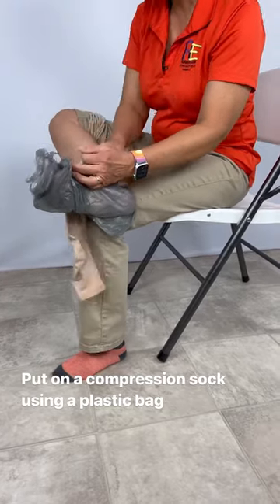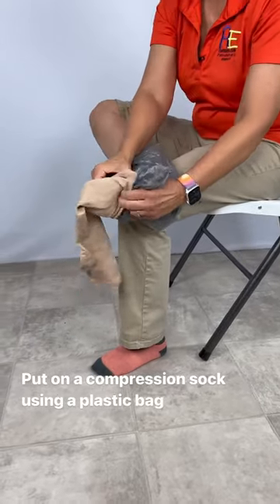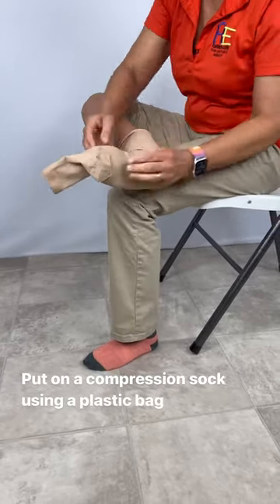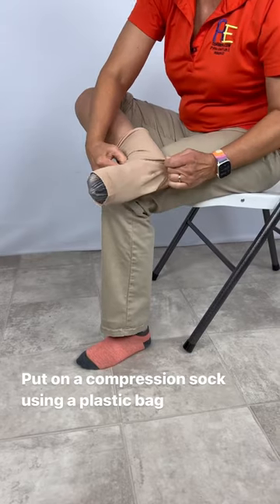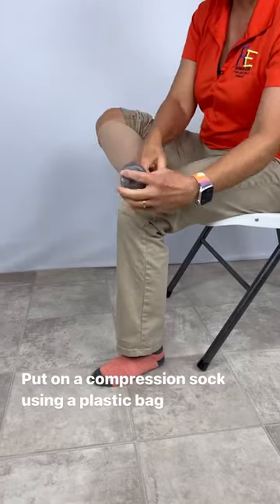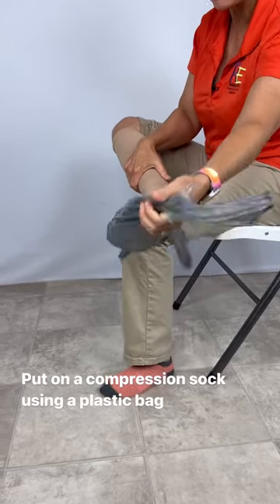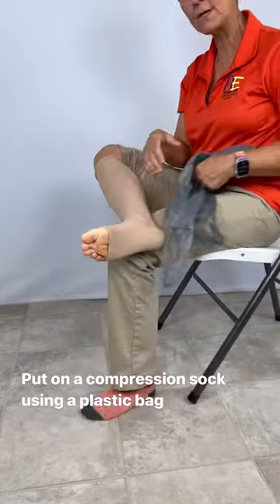I'm going to take my compression stocking and put it over the end here. I always like to just try to get the heels set. I'm going to pull this up just like that, and then as I pull my plastic bag out, I'm just going to kind of hold on to the stocking so that it stays in place.